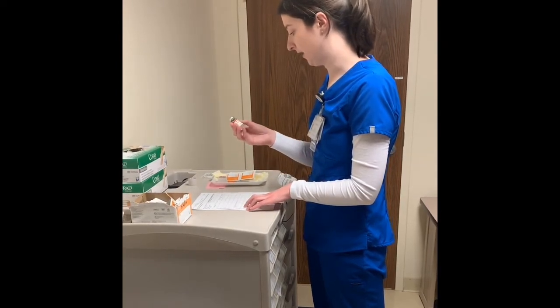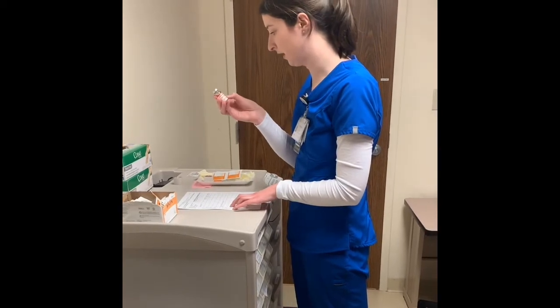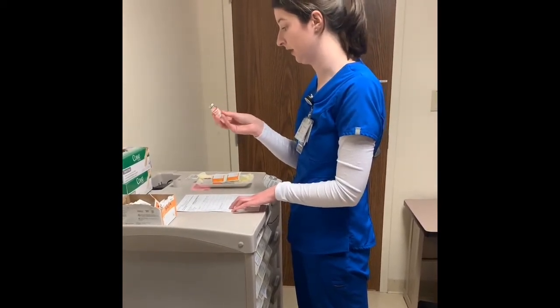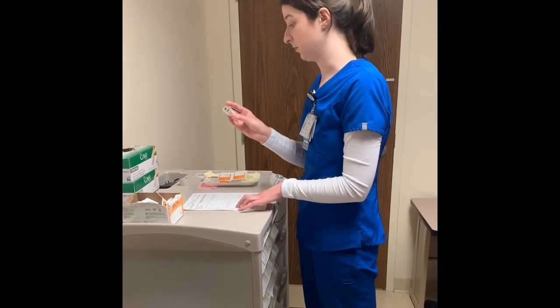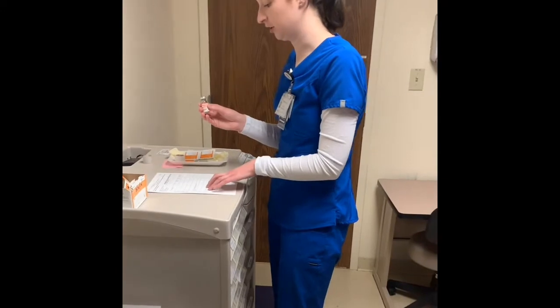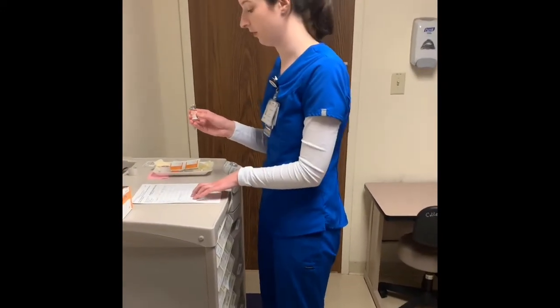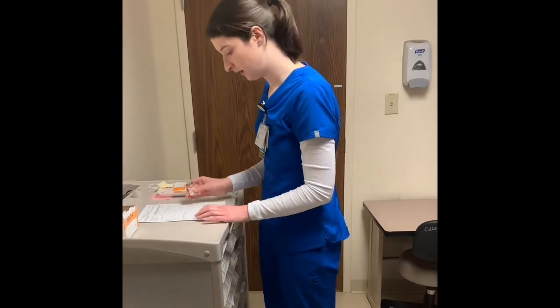The medication that I've pulled from the cart that I have in my hand right now is regular insulin concentrated at 100 units per milliliter. We have already checked, it is not expired, as the expiration date is in May of 2026, and I will be delivering this injection subcutaneously into the lower right quadrant of the patient's abdomen unless I see reason not to.